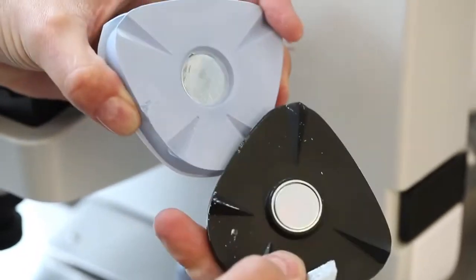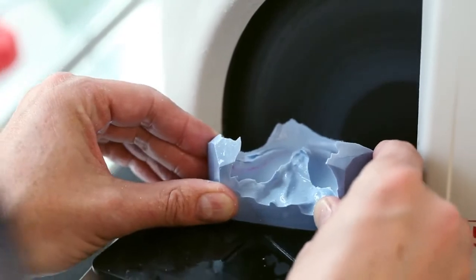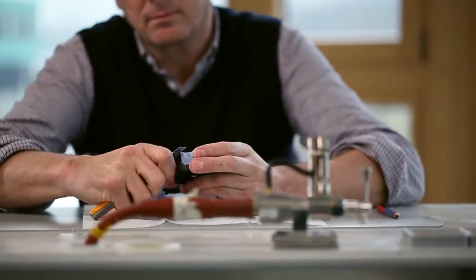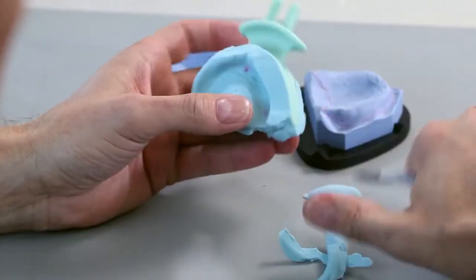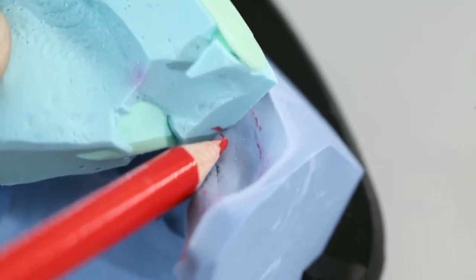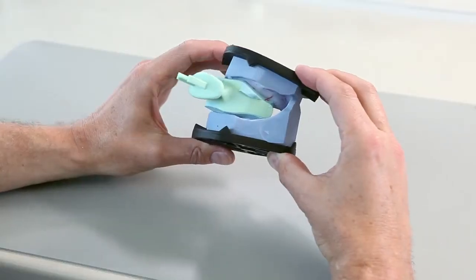stage. Use a split cast plate. Detach it now. Trim the models and smoothen the sharp edges. Cut back the preliminary impression to ensure stable 3-point support of the models. Mark the position of the centric tray on the model to support the reproduction of the close-fitting 3-point support.